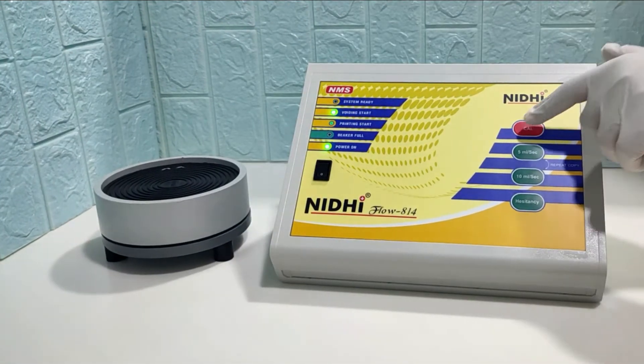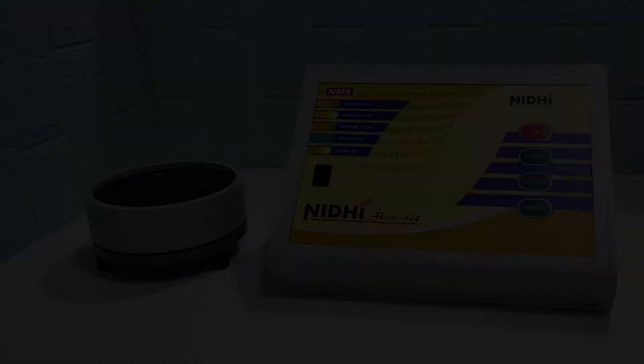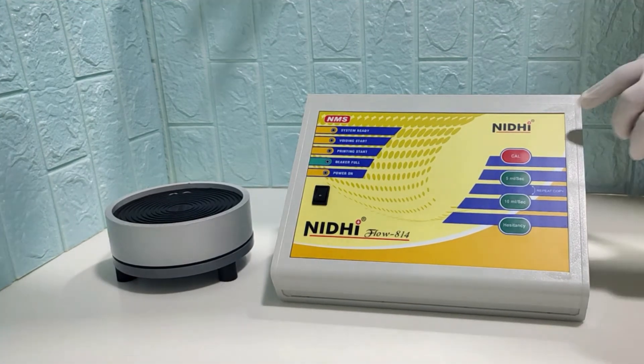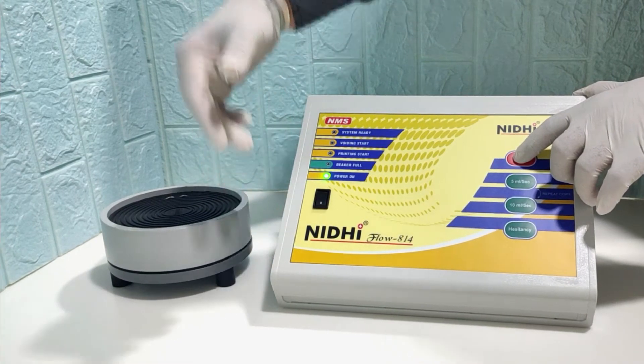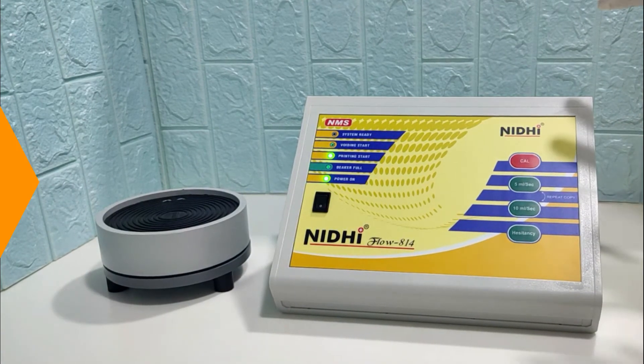Release the calibration switch once the voiding start LED glows. Make sure that you immediately release the calibration switch once the voiding start LED glows, otherwise the printing start LED will glow and we will have to restart the process.